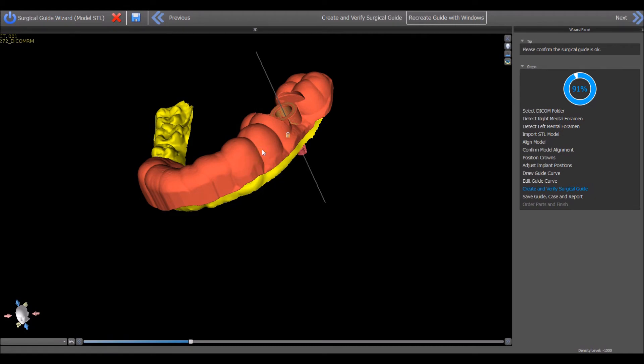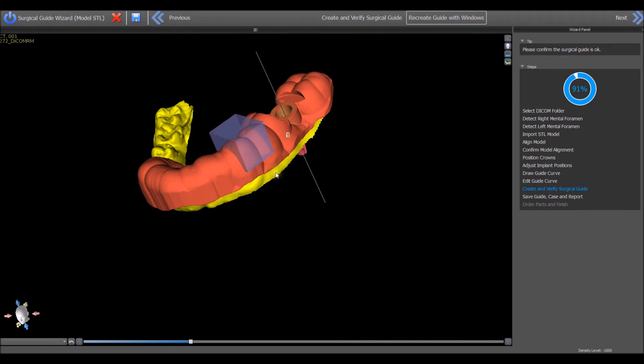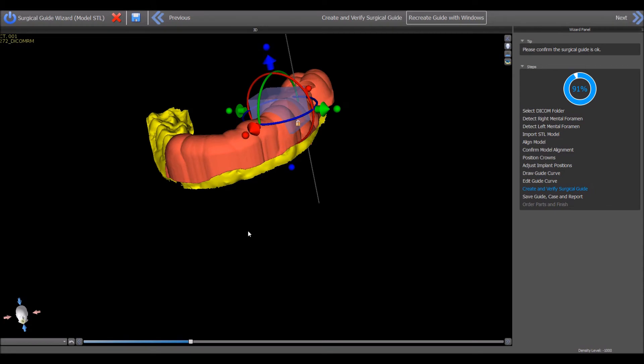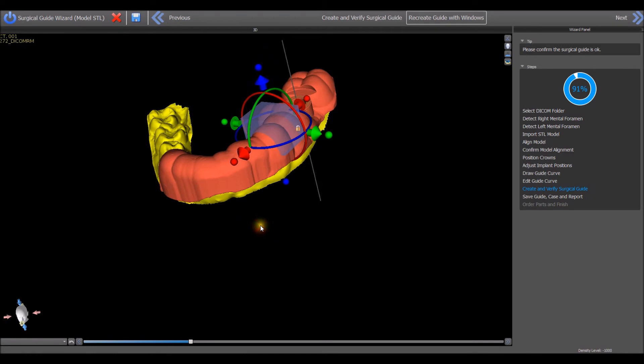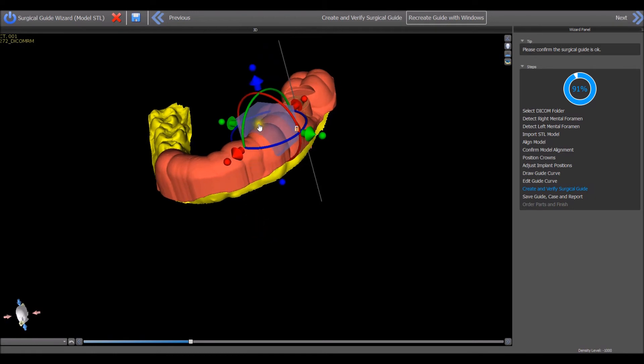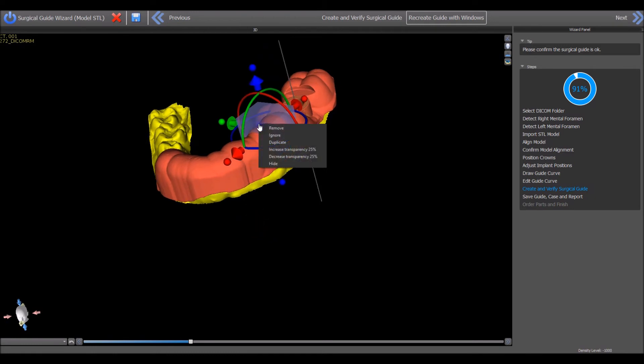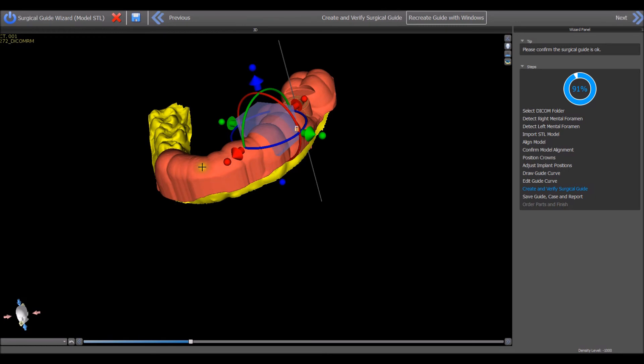Right clicking again in the location of the block will open the menu to add a window or show windows. A second window can be created by right clicking in a new location and choosing add window to place a new block, or right click on the existing block and choose duplicate and then left click in the location of the new window.